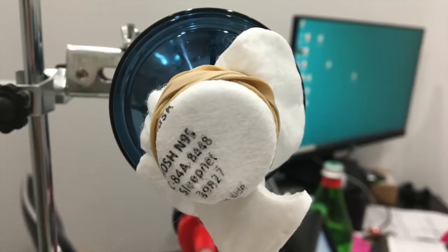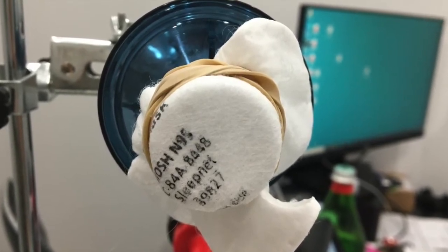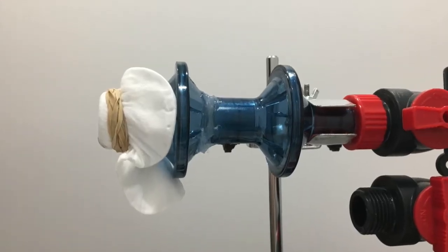But an engineer named Kelly came up with the idea of putting a rubber band around the filter and connecting it directly to the apparatus that we have for counting particles. Here's a photo from the front and from the side showing that setup with the rubber bands.